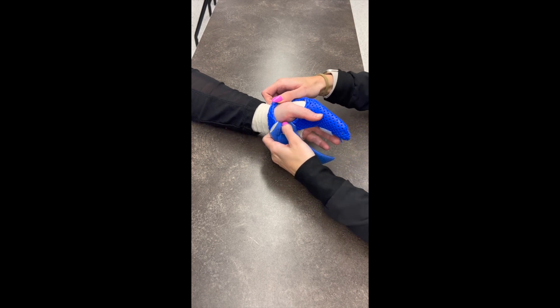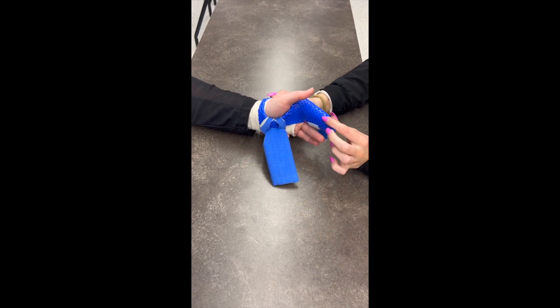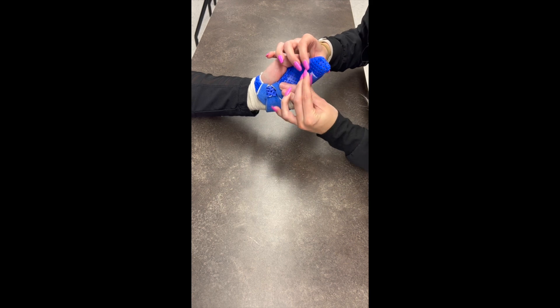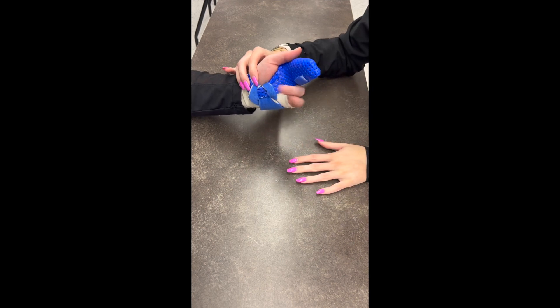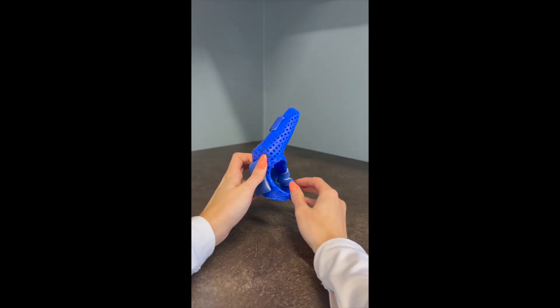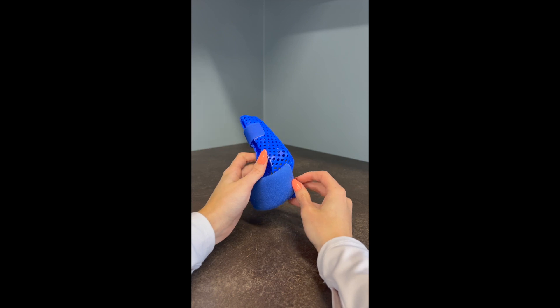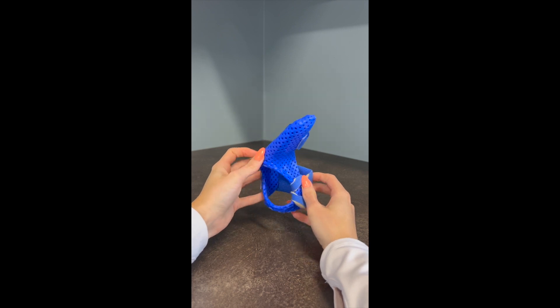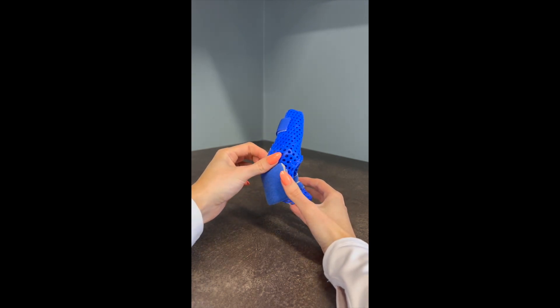Here is the final product. You can leave out the fingertips if preferred — some patients want them out, some want them covered. The palmar strap comes around the dorsum of the hand and attaches at the back. The finger strap wraps around the digits. Have the patient wiggle their adjacent fingers to make sure it's not limiting motion or rubbing anywhere, and verify they have full wrist flexion and extension.